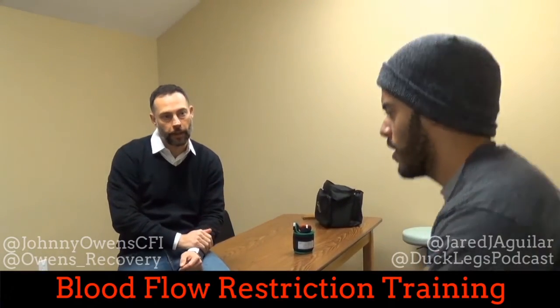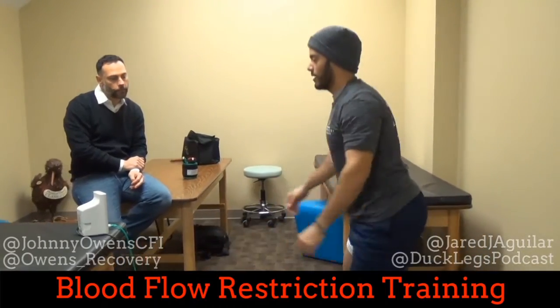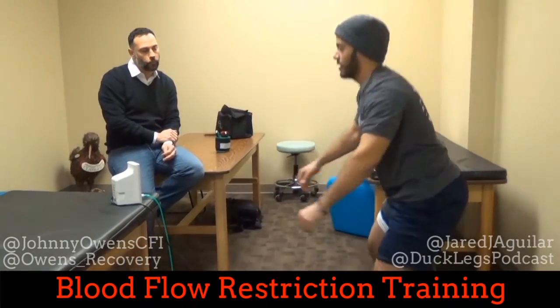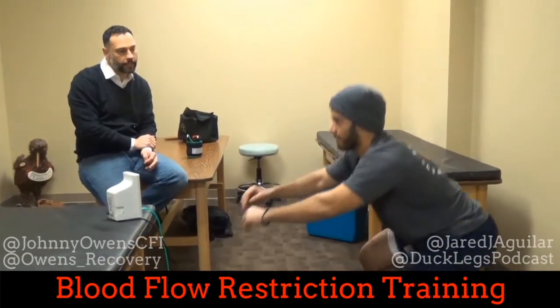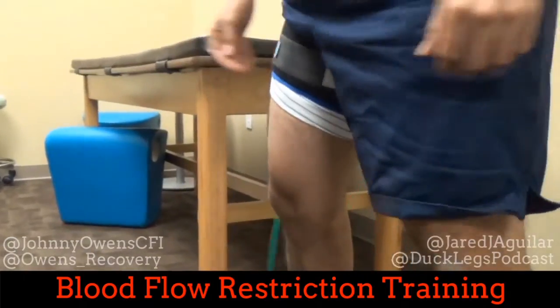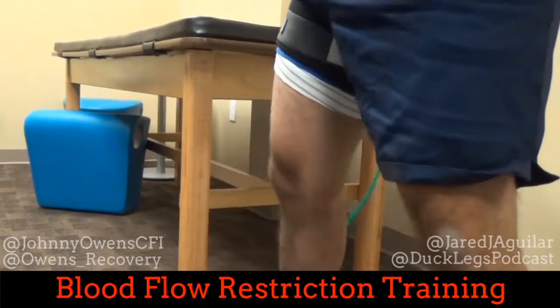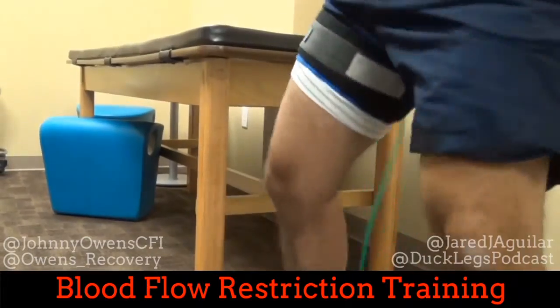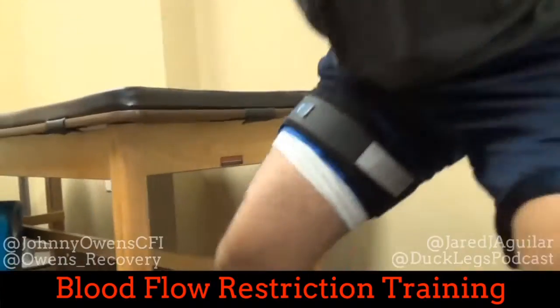Now you're going to start getting into more of these fast-twitch fibers. This is a three sets of 15. This is where the real magic happens — we're in fast-twitch territory. These big, wide, medical-grade tourniquets make sure none of that lactate leaves, so you're going to start building up metabolites within the muscle. Lactate starts to build up, and now your pituitary gland is starting to get stimulated from your type 3 and 4 afferents.